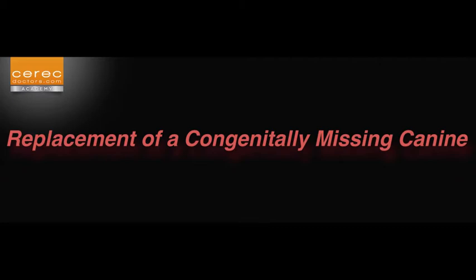Starting with this webinar, we will start a series of surgical video presentations that will delve more into the detail of exactly how specific implant surgical indications are performed, and hopefully these videos will provide a good learning experience. In this webinar, we'll discuss the replacement of a congenitally missing canine. In subsequent videos, we'll not only show the surgical video demonstration, but also the planning that goes into a lot of these cases, because that is equally, if not more important.